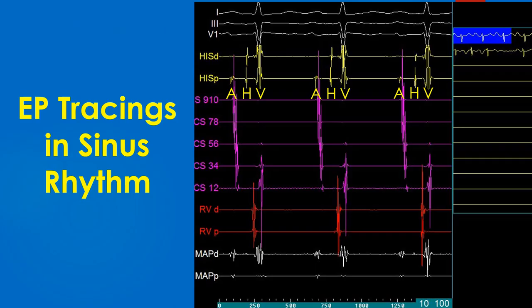EP tracings in sinus rhythm: the upper three tracings are surface electrocardiograms — leads 1, 2 and V1 in white colour. The next two tracings are from the His bundle catheter: His distal and proximal. The large broad deflections in these tracings are the ventricular electrogram V, while the triphasic signal prior to it is the His potential H, and the deflection before that is the atrial electrogram A. Five pairs of electrodes in the coronary sinus are numbered from distal to proximal, so that CS9,10 is the proximal pair and CS1,2 is the distal pair, with other pairs in between. All tracings from the coronary sinus electrode are in violet colour.